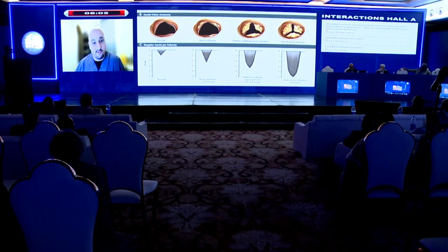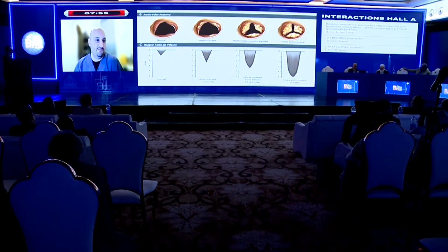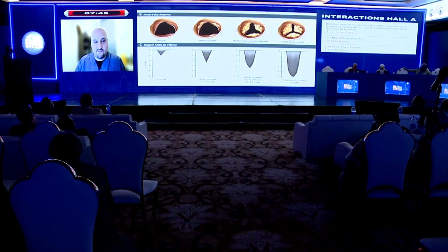John covered bicuspid aortic stenosis in great detail, so I'm not going to talk about that. Traditionally speaking, those patients are divided into risk groups depending on their expected risk of mortality from surgical aortic valve replacement: low risk, intermediate risk, high risk, and very high risk or inoperable patients.